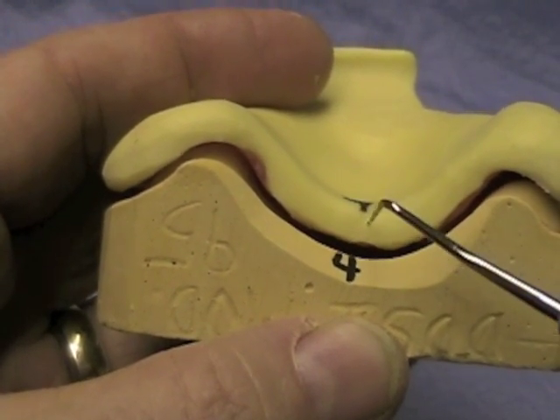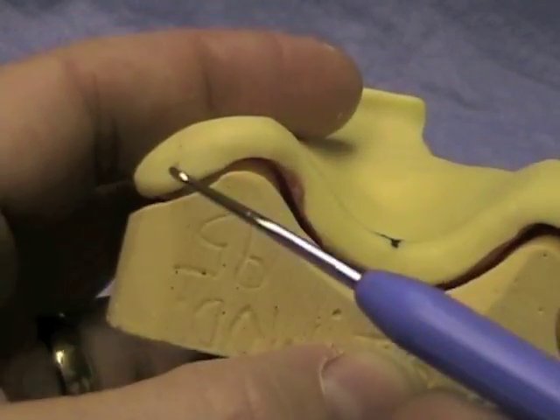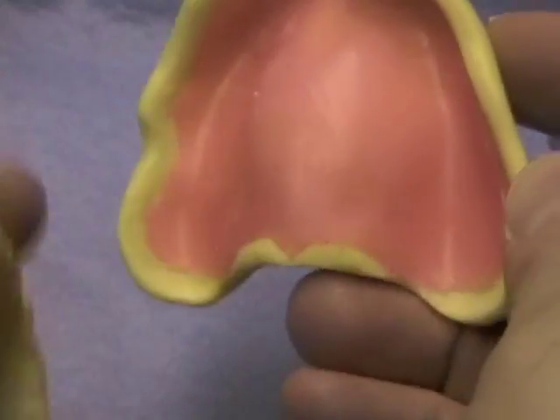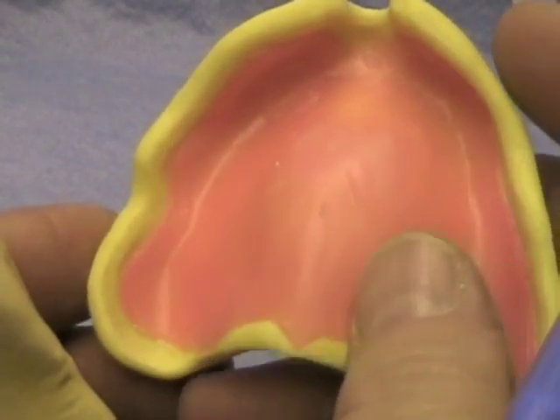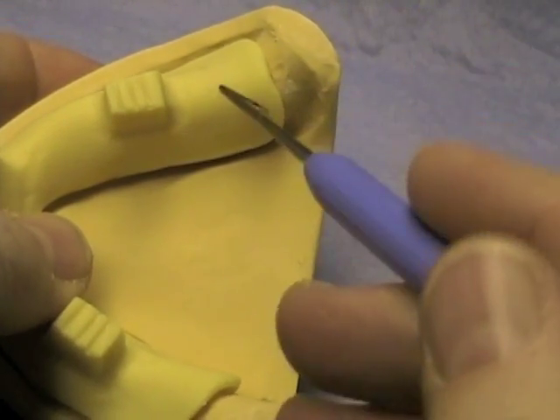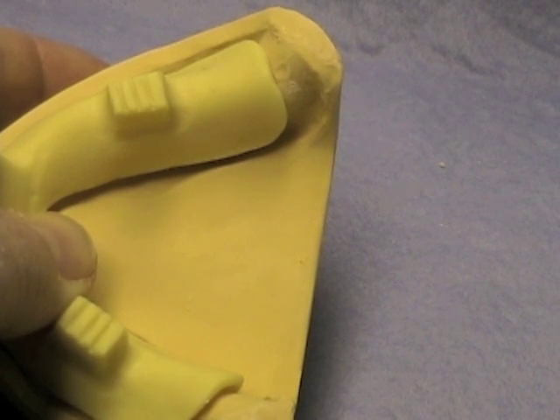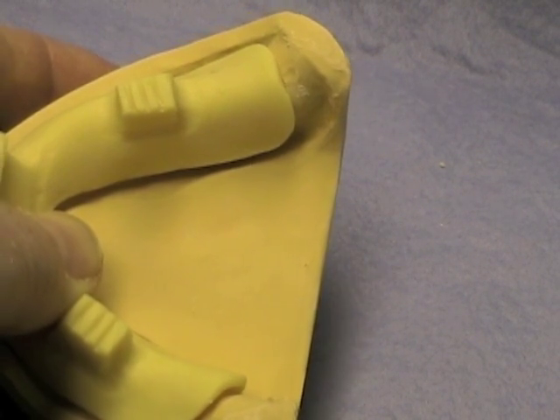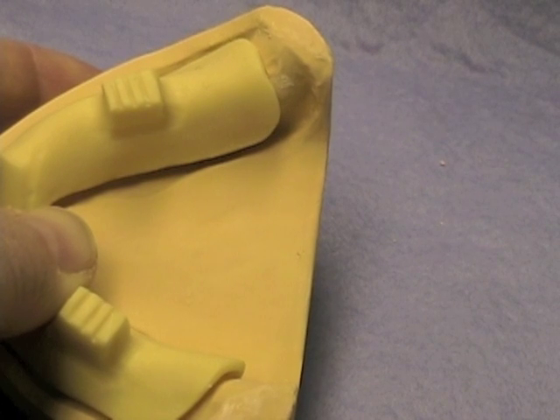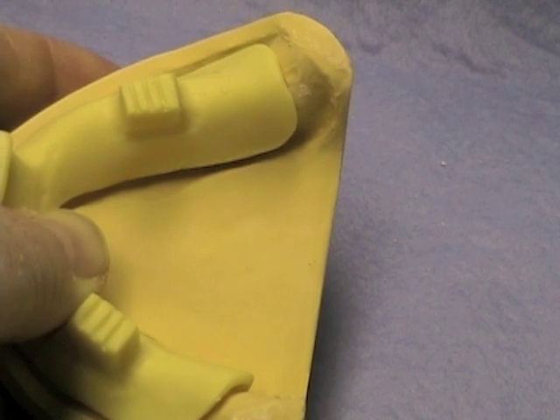This tray is too thick. The back edge is going to cause the patient to gag, and because the flanges are so thick, they will distort or pull out the vestibule as well. This tray is short of the retromolar pads — that's not going to work. You'll need to make a new tray or make an addition. Trying to add compound to the back of the tray is going to be extremely difficult; you'd be better off extending the tray with some acrylic.